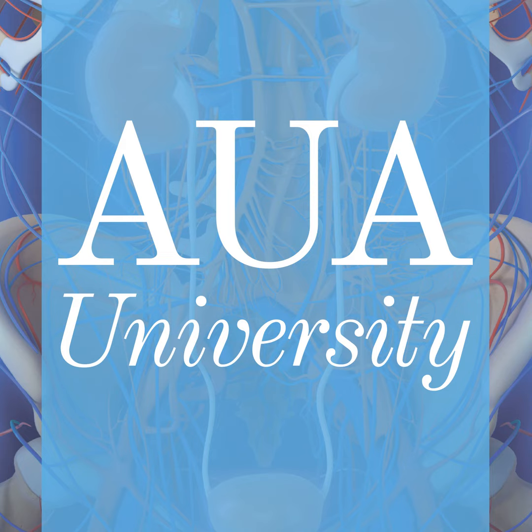So those are the different clinical scenarios when you might use a PSMA PET CT scan. It has been shown that it is a very valid tool to identify occult metastatic disease in patients who have locally advanced high-risk prostate cancer. It is a very valid tool to identify the localization and the extent of metastatic disease or locally recurrent disease in patients who have been treated either by radical prostatectomy or by radiation therapy. It is a good staging tool in patients who have metastatic mHSPC, and as I said, it's a good staging and treatment decision tool in patients with castration-resistant disease.